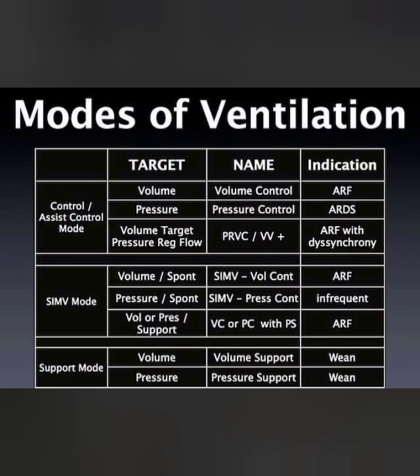This is the chart showing the different modes of ventilation: control, assist control mode, SIMV mode, and support mode, as well as all the different targets. The different indications of the different modes are also shown in this chart.